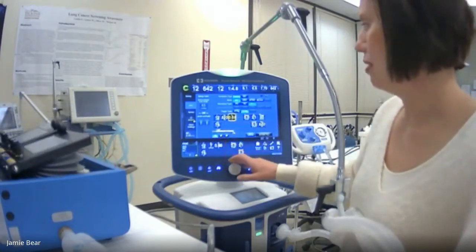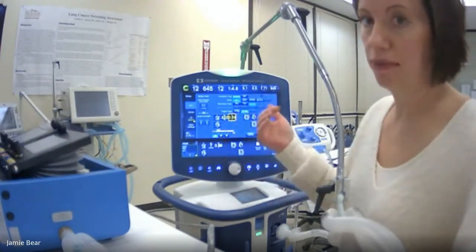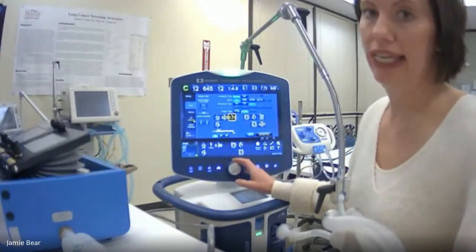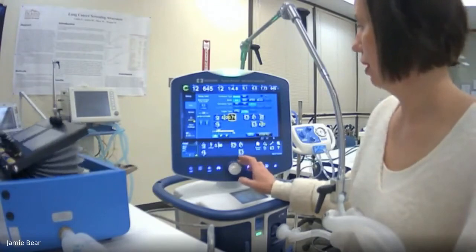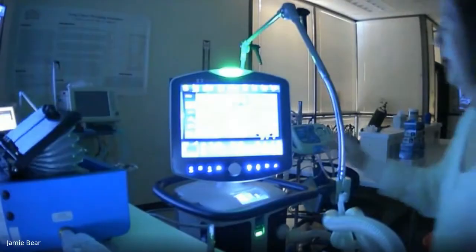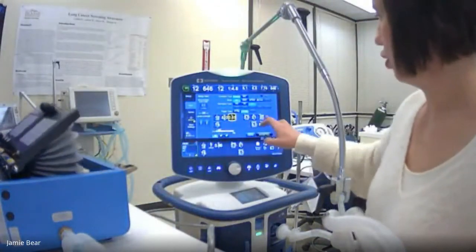Our I time now, this is a pressure mode. Okay, it's a pressure controlled mode, so we can set I time. What we cannot set is a consistent flow, because it will change. Okay, so let's go to that 0.85 again. Okay, and we can still change our rise time because this is pressure control.